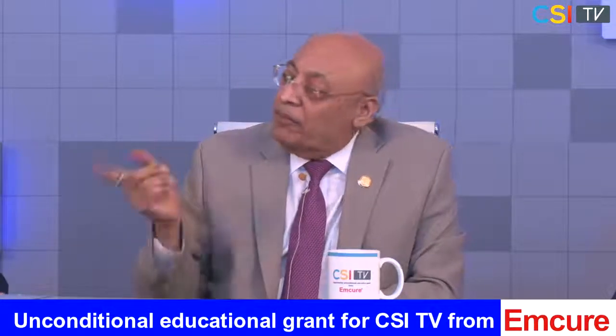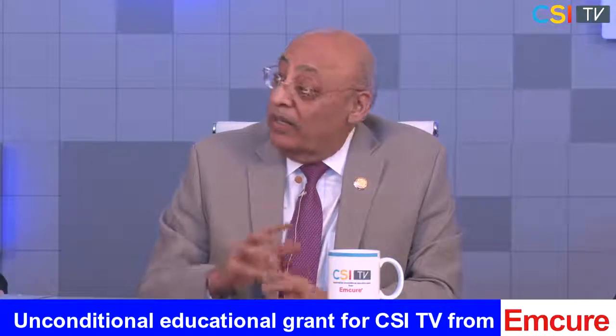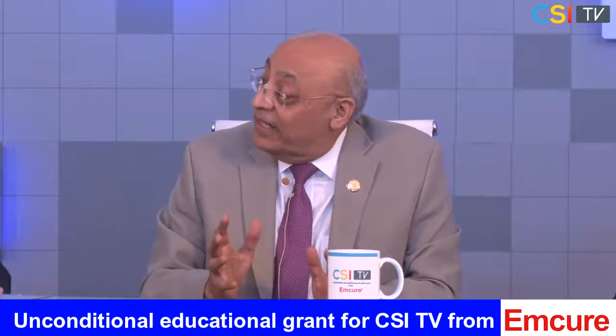Let me ask a question, Nitinji, of Jeroen. GLS, as you very well know, is the global longitudinal strain, not the regional one, and all that is just based on the convenience of measuring it.